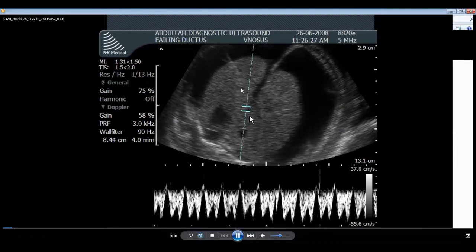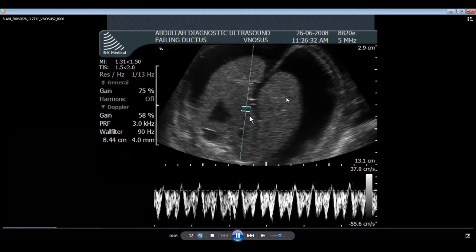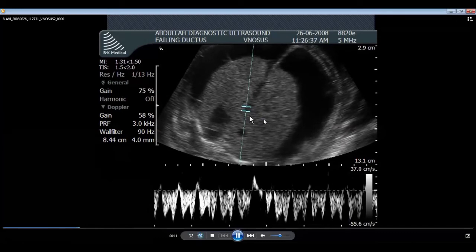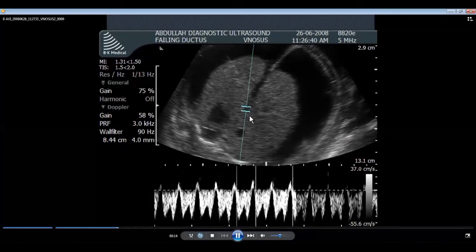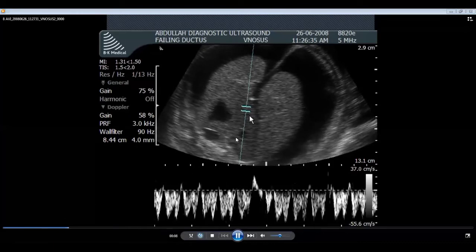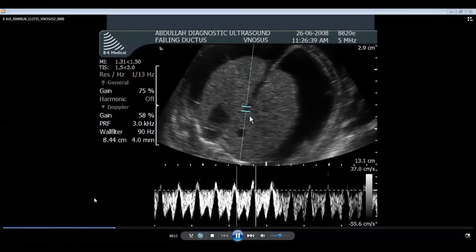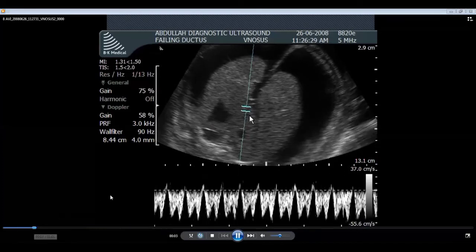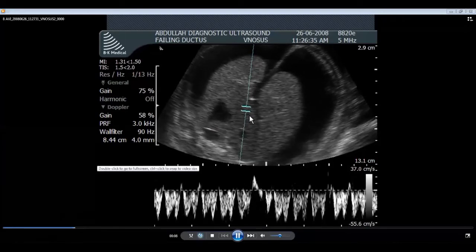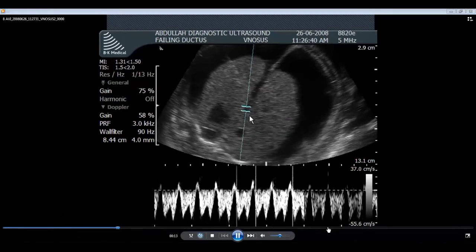There we are. This is the needle, and there you see the needle tip. You can actually see blood going in. You can see the particles. There you see the particles moving, and here also, here as well. I'll show you once again. There, this one, this shining particle as we are pushing the blood in. So, my dear, this is it.